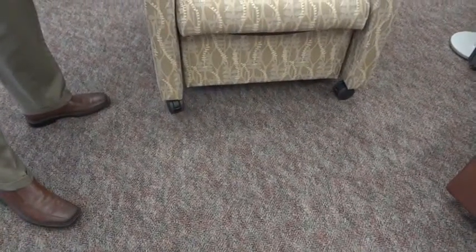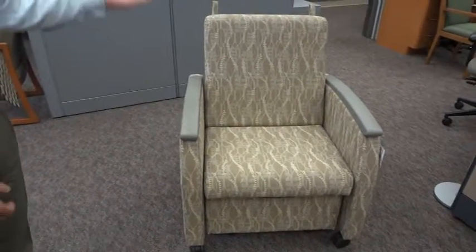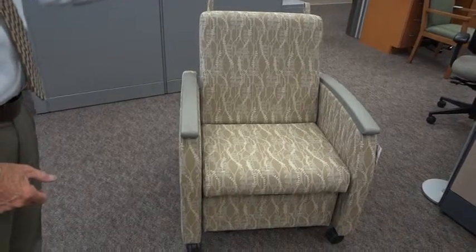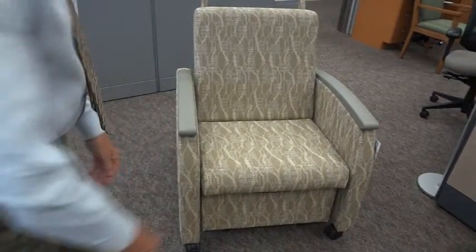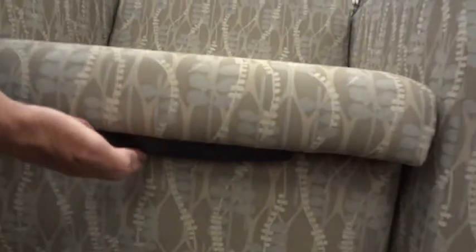Whenever it's time to pull the chair back to its upright position, you just brace yourself against the right arm or the left arm depending on if you're right or left-handed, and you reach down to the loop. You just pick up on the chair and bring it to this position, then push it in place and it will relatch and lock itself.